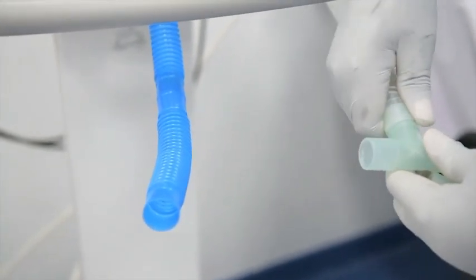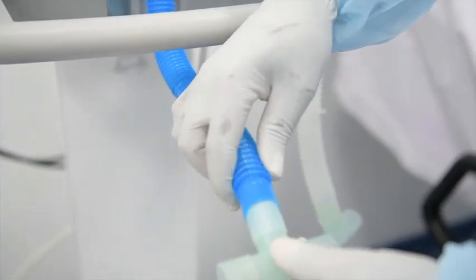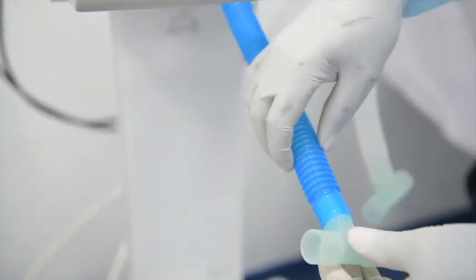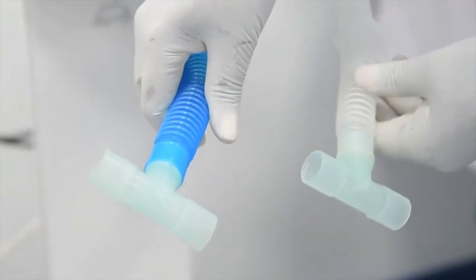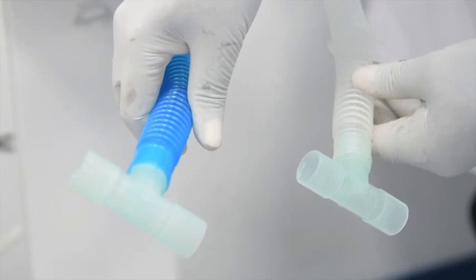So one T-piece will connect on your inspiratory arm, and the other T-piece will connect on the exhalation arm as well. This will allow the connection for the two patients to get inspiration and exhalation.